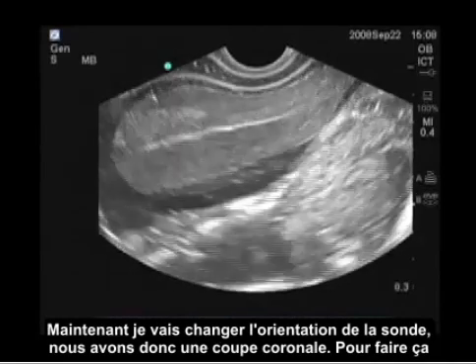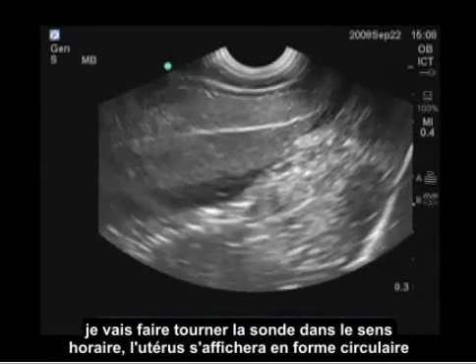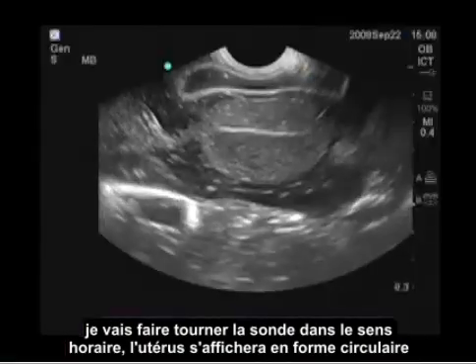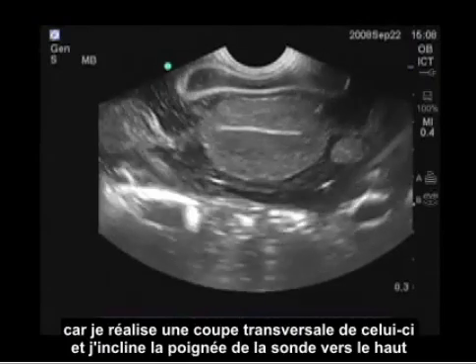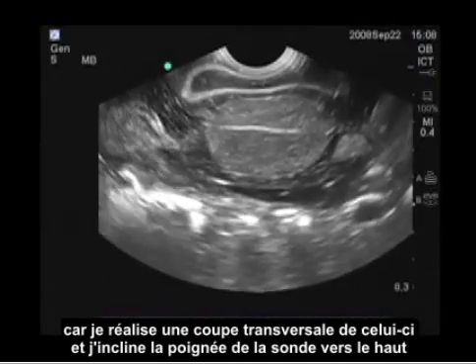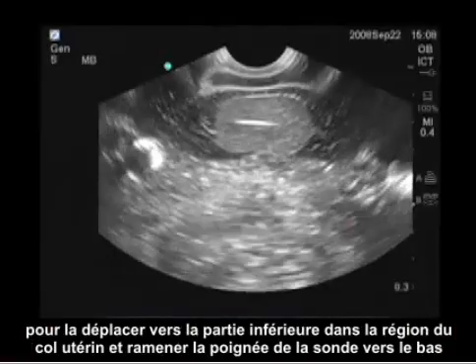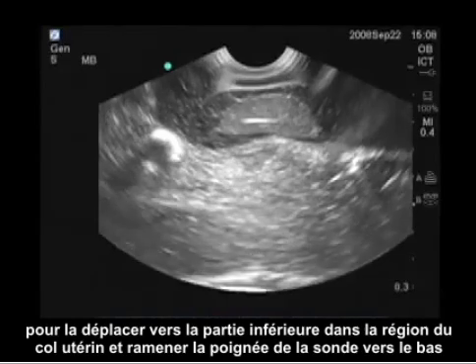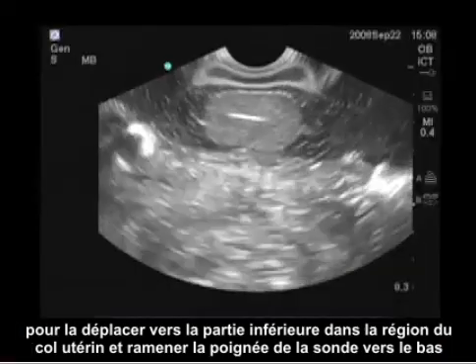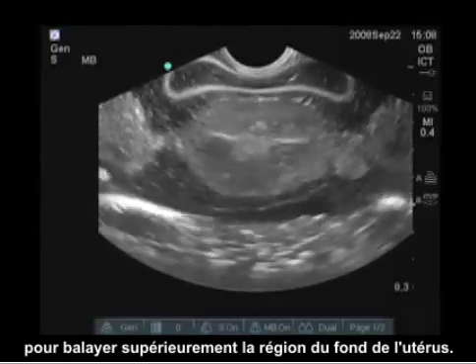Now I'm going to change the orientation of the transducer to a coronal view by turning it counterclockwise. The uterus will appear circular because we're cutting a cross-sectional view. I tilt the handle of the transducer up to move inferiorly down into the region of the cervix, then bring the handle down to scan superiorly into the area of the fundus of the uterus.